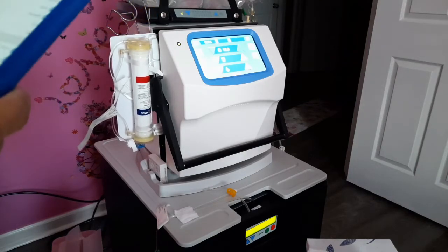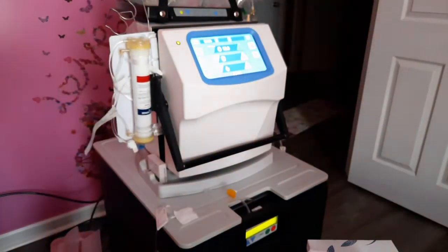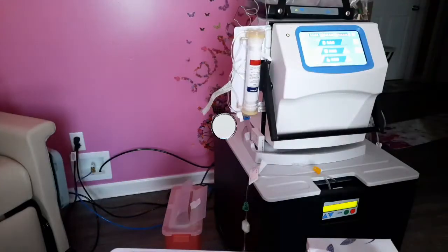So I changed that. It says, is the warmer being used? Yes, it is. So then pre-treatment weight, it's got my previous post weight already on there. It has my dry weight information. And then it'll tell you how much weight we need to remove. So let me enter my current weight. I'll be right back.